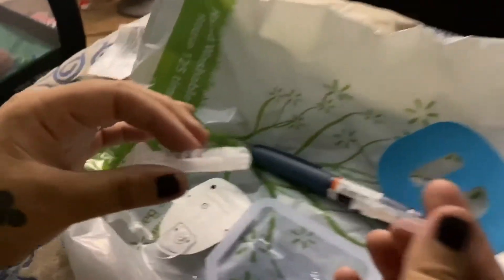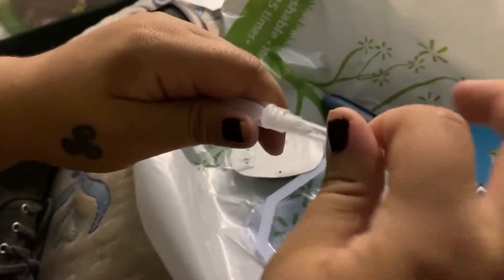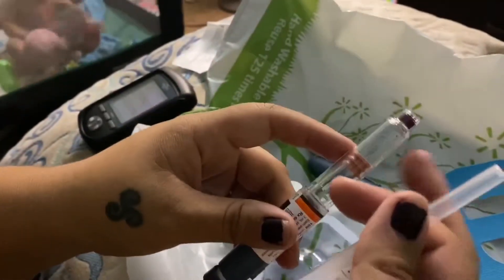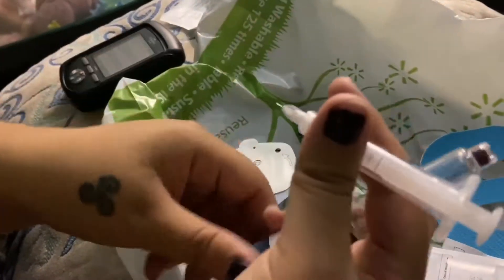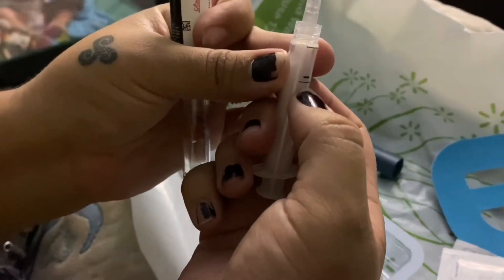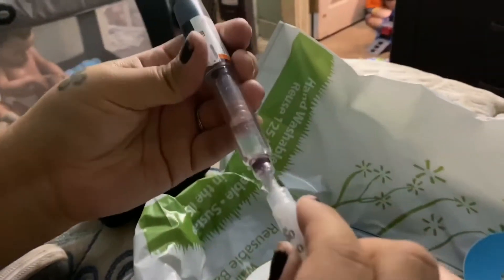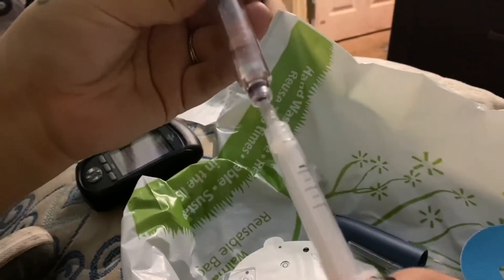Let me flip you guys around — that will be much easier. So this basically comes with a needle part that you just screw on like that. We use pens right now and have to draw the insulin from it. For us it's 100 units of insulin, so it will be this tiny line right here. I'm going to poke on the inside of this and draw 100.